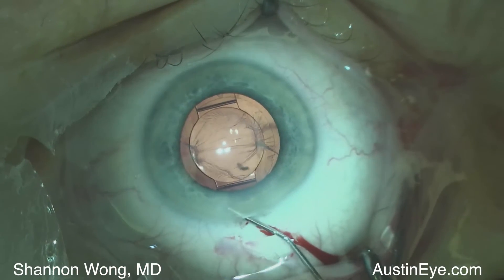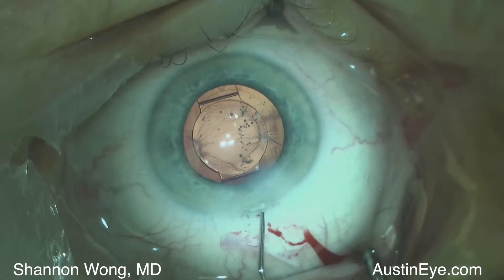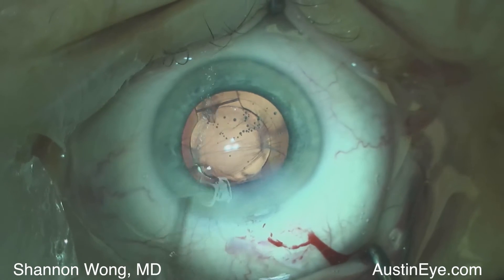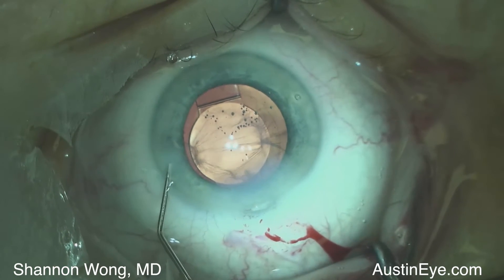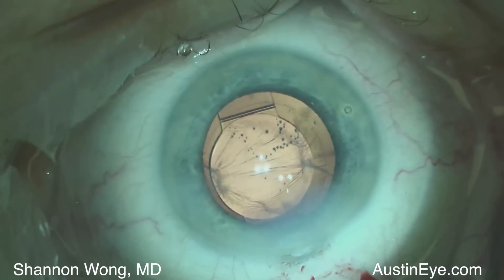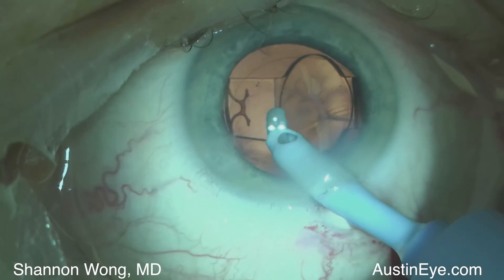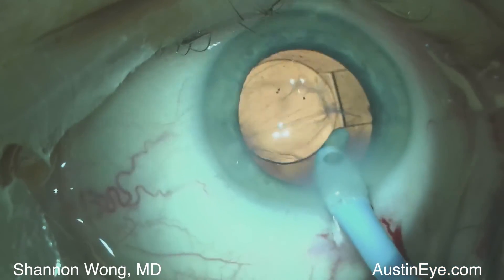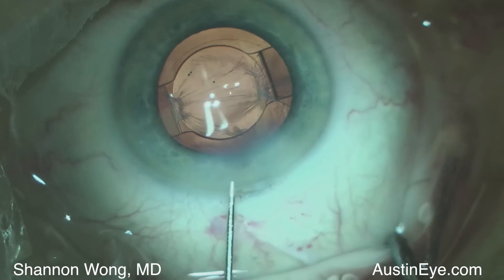We then remove the viscoelastic with irrigation and aspiration, fill the eye with balanced salt solution, and determine if the Crystal lens optic will lay flat. In this orientation we find that the inferior haptic is more posterior than the superior haptic, so we elect to rotate the lens an additional 90 degrees, making sure that the haptics of the Crystal lens are not ensnared in the capsular tension ring.